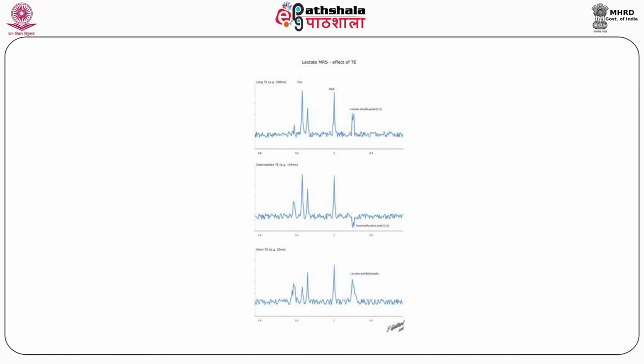Analysis of a spectrum. There are two ways to analyze. One is the qualitative, the other is the quantitative. In the qualitative, we have visual, the character of the peak, the position of the peaks, the intensity of the peaks, the form, and area, more important than the amplitude. We can also use certain ratios like NAA creatine ratio, choline creatine ratio to analyze these peaks. Spectral resolution is the difference in resonance frequency between two molecules; better resolution with the stronger magnets can be obtained.